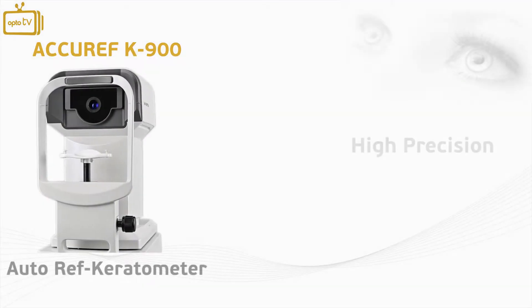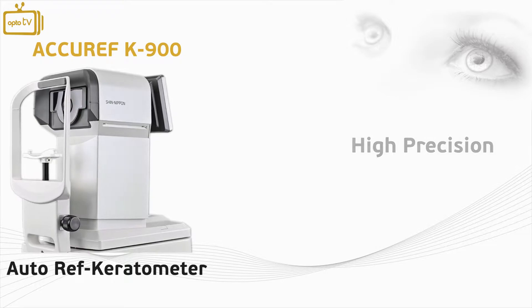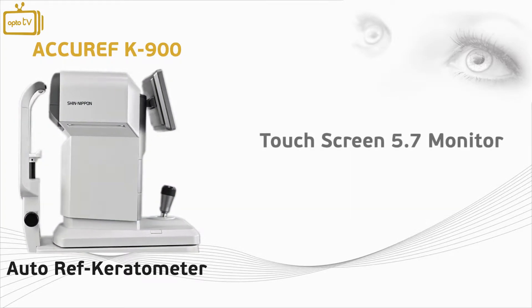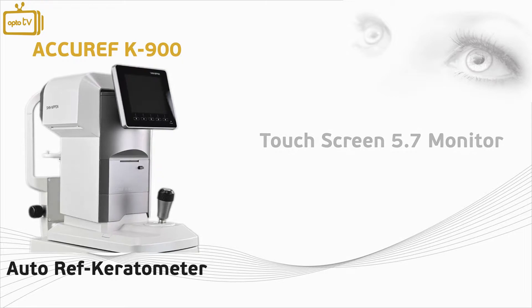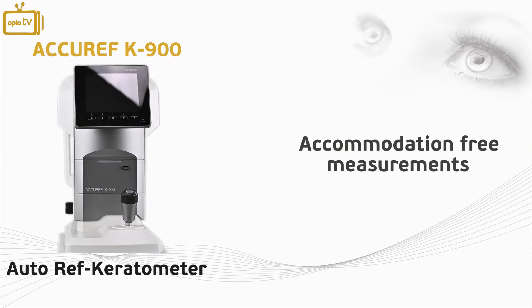With a new corporate transformation, Wrexham introduces the excellent high-precision newly designed Acurif K900 Autoref Keratometer. The K900 is equipped with an HD 5.7 inch touchscreen monitor with feather touch sensor buttons and allows the user to perform accommodation-free measurements.